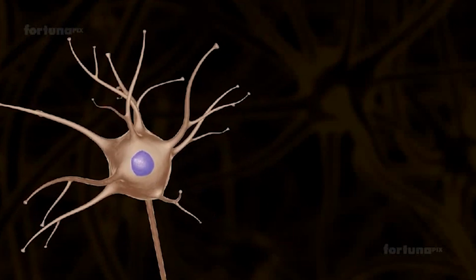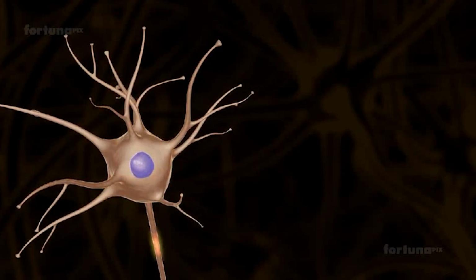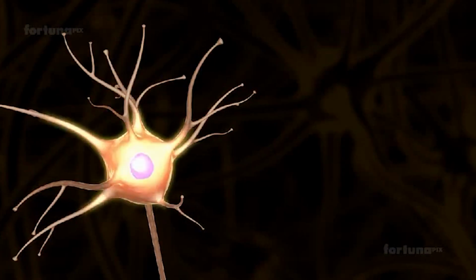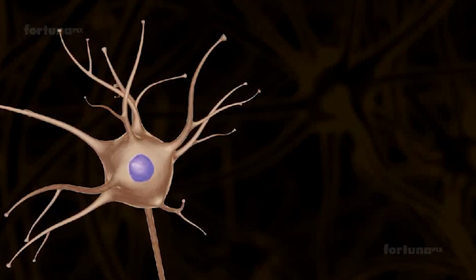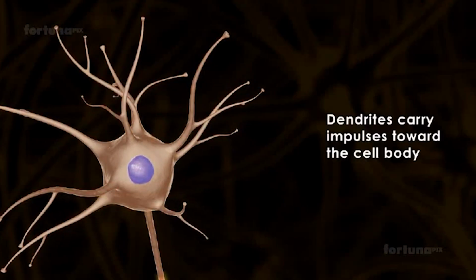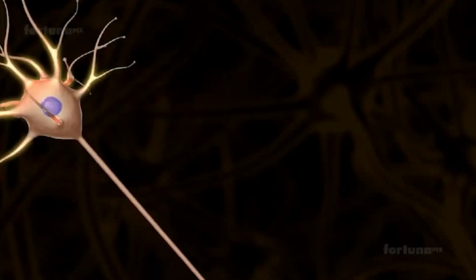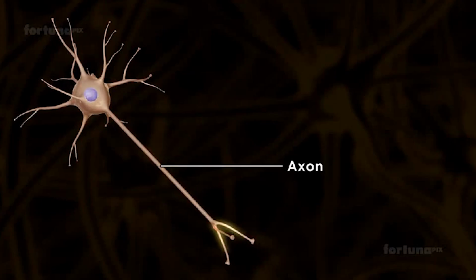Lots of hands, but one leg they use to kick this info, and so I, the neuron, have caught a bunch of balls, information, but I can give them to another neuron only by kicking with the leg, and when I kick, an action potential occurs, which is what the Neuralink chip records. An action potential is an electrical signal. Yes, we have electricity in the brain, and it's exactly this electrical signal that the chip scans.